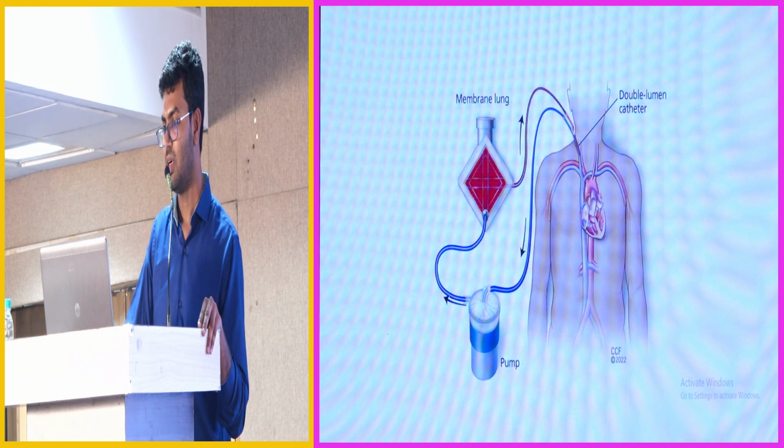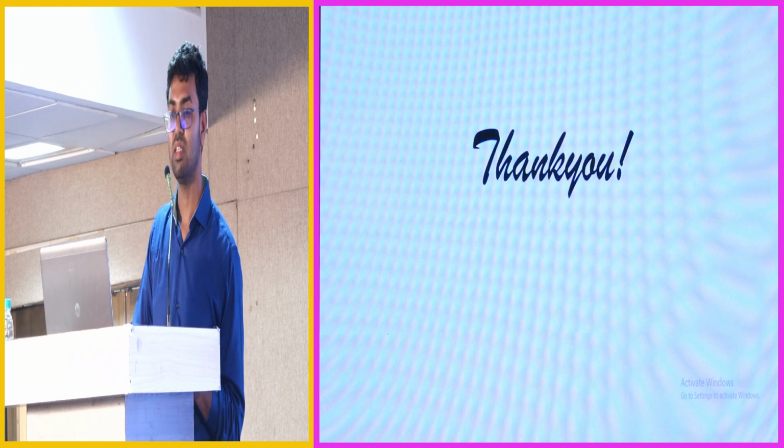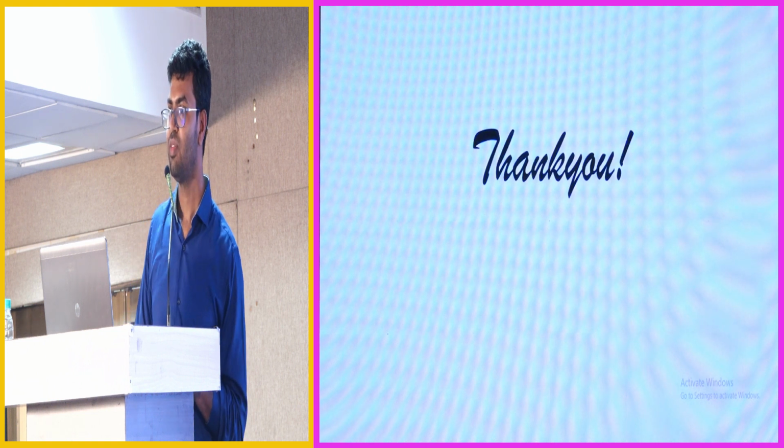Okay. So these are the various ECCO2R pumps that are available commercially. As you can see, the pump flows will be very low, 400 ml, 500 ml like that. Okay, that's it. If you have any questions.